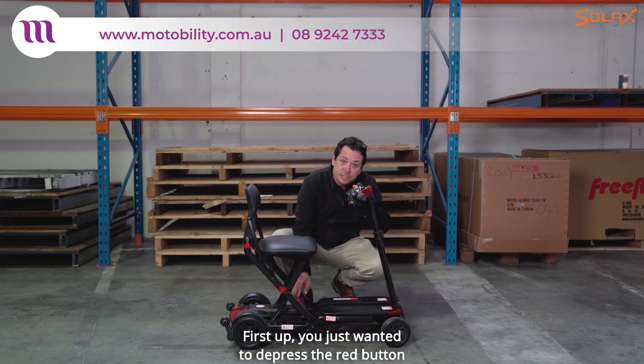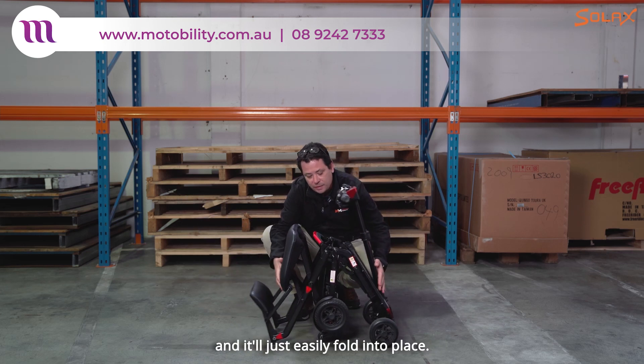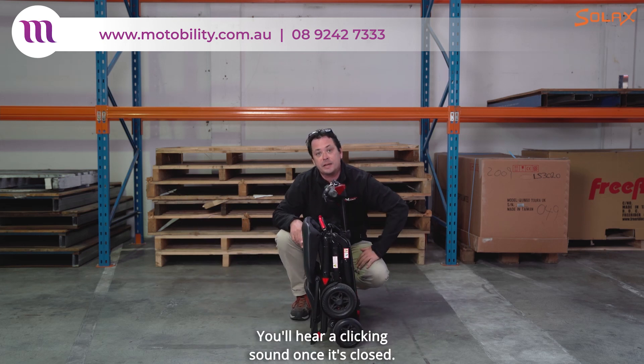First up you just want to depress the red button on the scooter and then just lift it up and it'll just easily fold into place. You'll hear a clicking sound once it's closed.